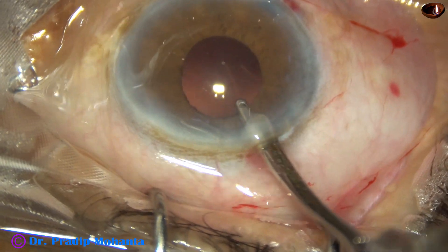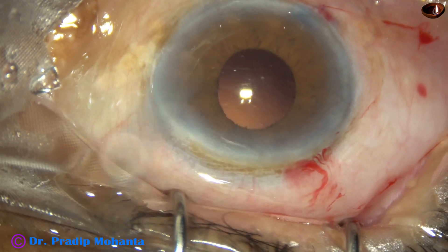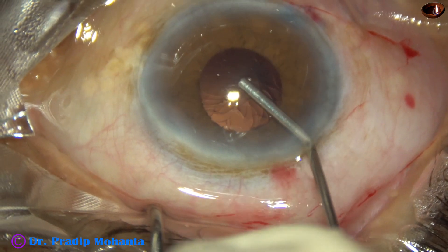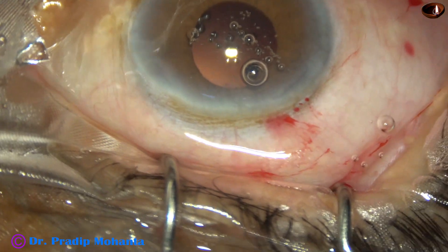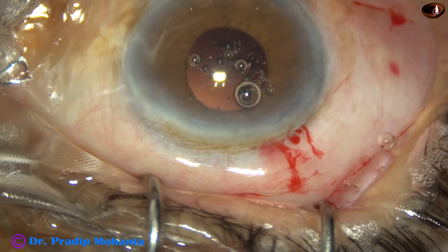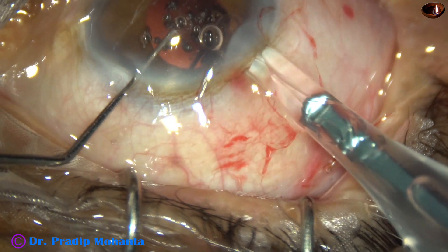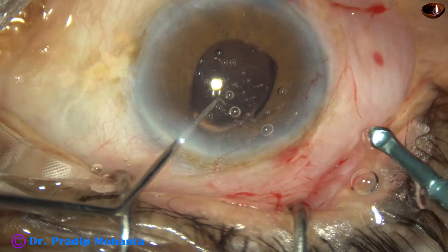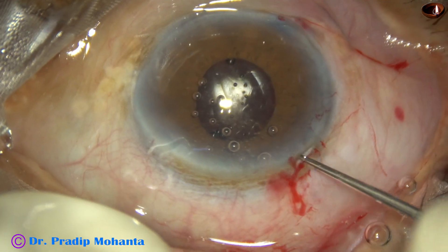Cortex is nicely removed. Once the cortex is removed, our next step is to implant an intraocular lens. In this case, a hydrophilic acrylic single-piece monofocal lens has been selected. The lens is placed in the bag with a push of the left-hand instrument.